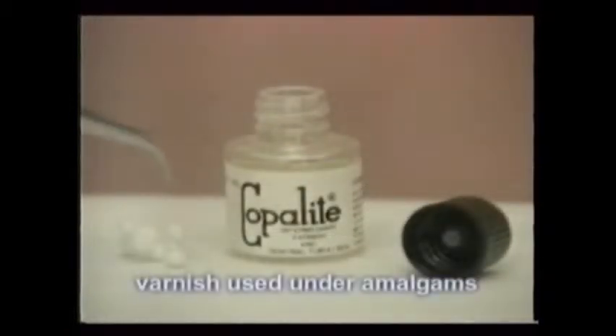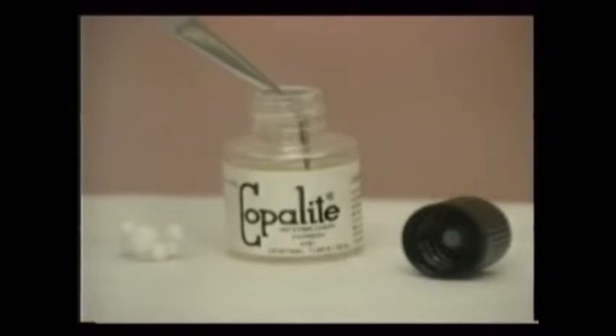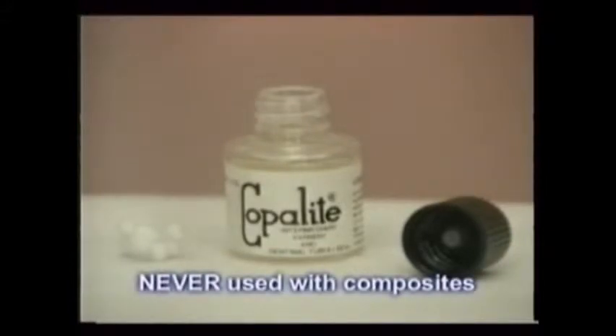A varnish liquid called copalite is used less frequently now to seal the dentin of a tooth from the metal of an amalgam filling. The copalite is painted inside the tooth with a cotton pellet and cotton pliers just before the amalgam is placed. It's never used with composites.